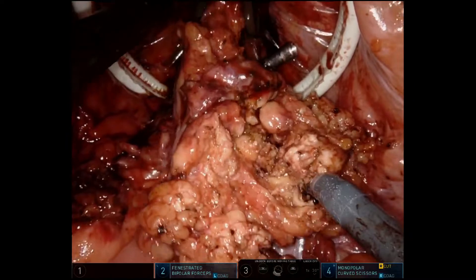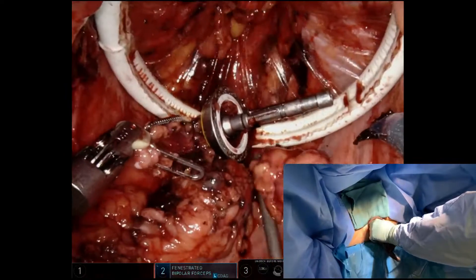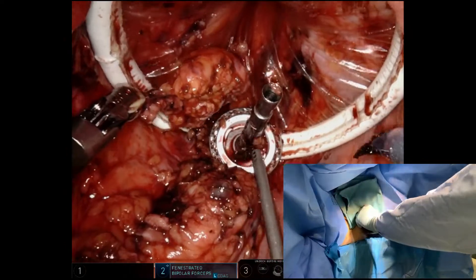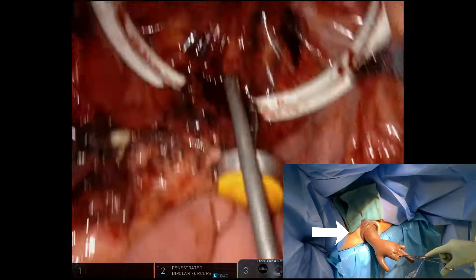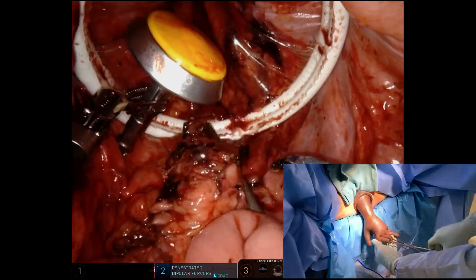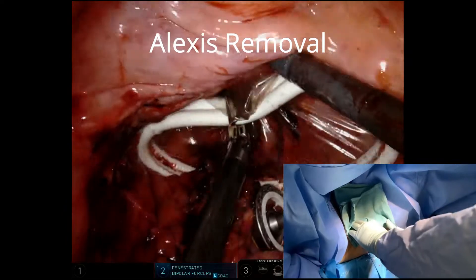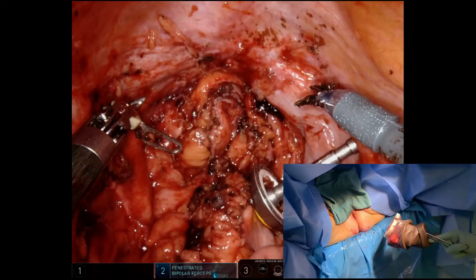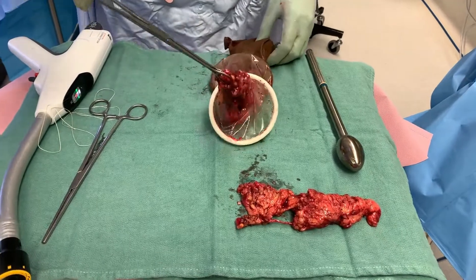We see the specimen staying in the glove as we're extracting the various pieces. We keep it in the glove, mitigating a significant release of aerosolized particles. We're taking out a third or fourth piece. The glove is now fully expanded — it's time to take the Alexis retractor out. We do that by inverting one of the fingers with the Kocher on it, being careful not to rip the glove. We grab the edge of the Alexis and gently pull it out, including the specimen. Everything comes out with the Alexis and the glove.